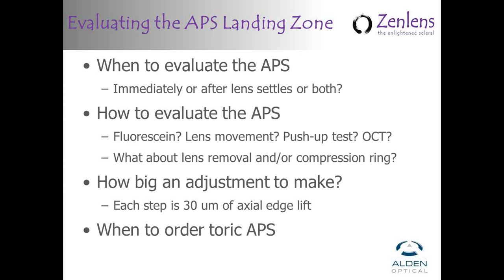But at return visits, we definitely use fluorescein. When a patient comes back for a week or two follow-up with a lens on their eye for a few hours, let's say, I always like to put fluorescein on the superior bulbar conjunctiva and watch it interact with the edge. A properly fitted scleral shouldn't have a lot of tear exchange.